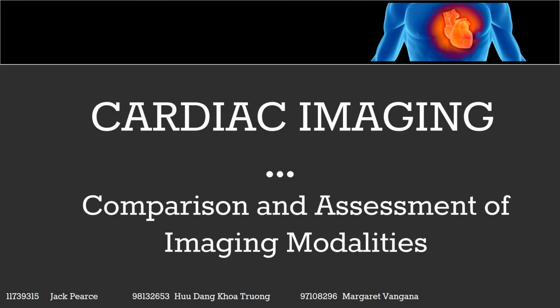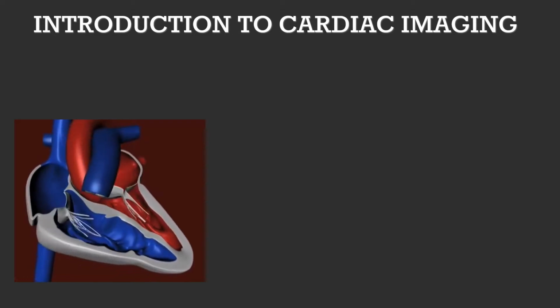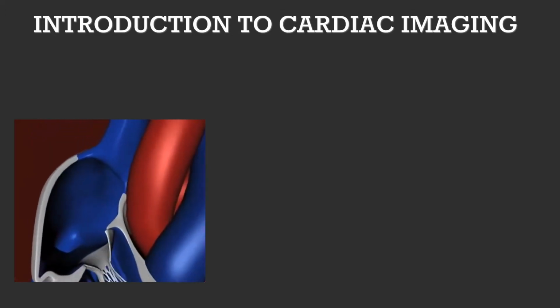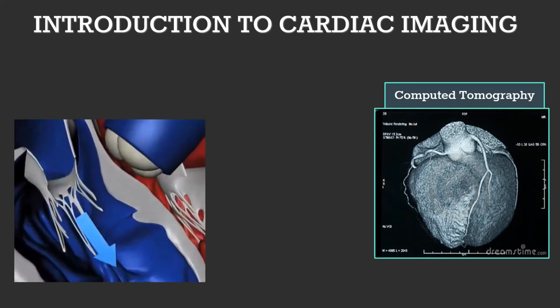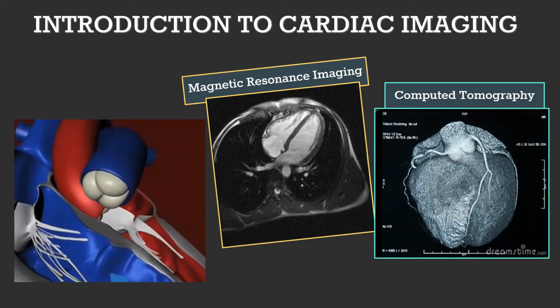Cardiac imaging, comparison and assessment of imaging modalities. Cardiac imaging is visualizing the structure of the heart and cardiac blood flow for diagnostic evaluation or to guide cardiac procedures. There are many different modalities, but in this presentation we will be comparing computed tomography with magnetic resonance imaging.